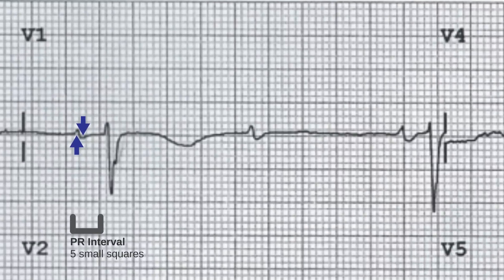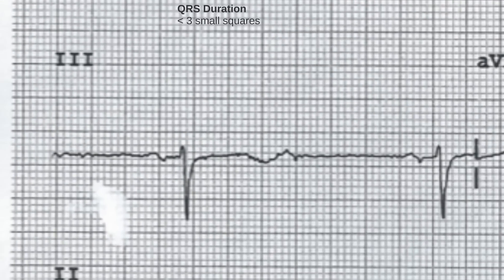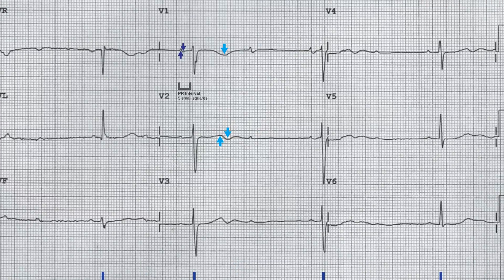The T waves are inverted in lead V1, biphasic in lead V2, and inverted in lead 3, all of which are considered normal findings. There are prominent U waves visible in the chest leads and probable QT prolongation.